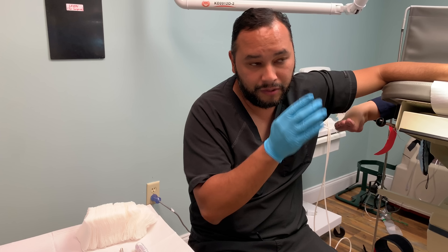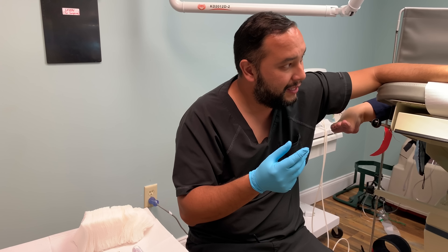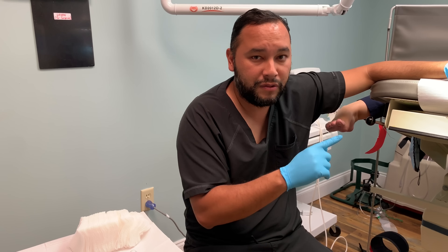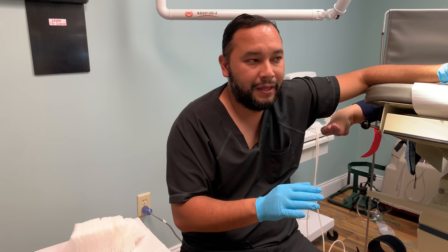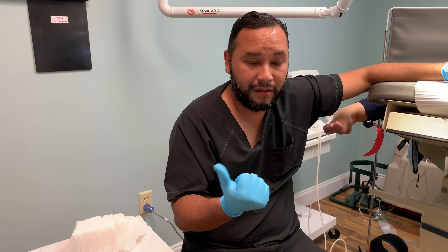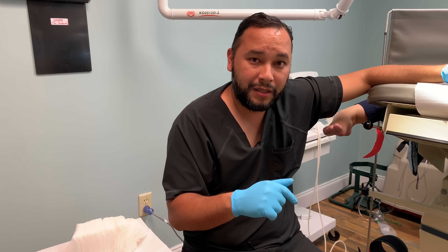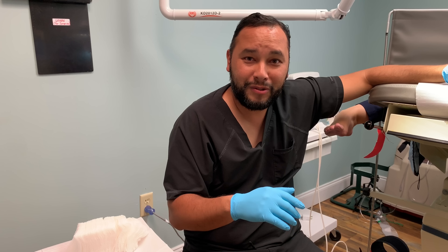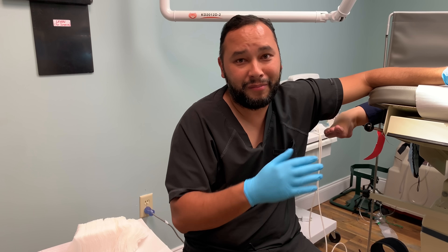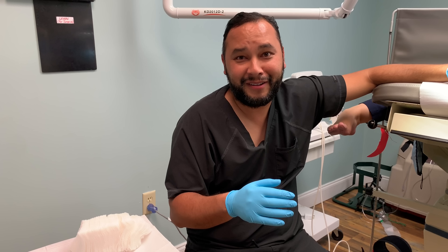So that's it. I'm gonna flush it out with some saline and sew it back up. I use that relaxed skin tension line incision so that it seals and closes properly, as opposed to the opposite where it doesn't heal as easily. Patient's gonna be placed in a surgical shoe so that we can minimize pressure to the area so that it heals properly. Patient's young so I don't anticipate any problems, but nonetheless antibiotics will be on board and also a tetanus update.